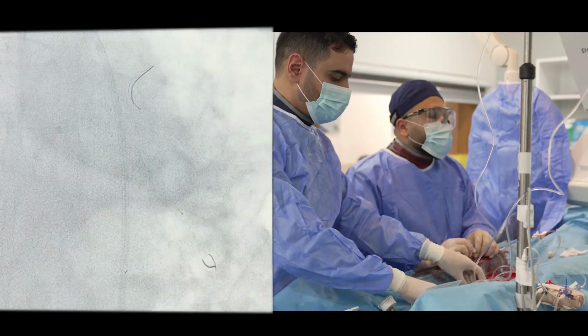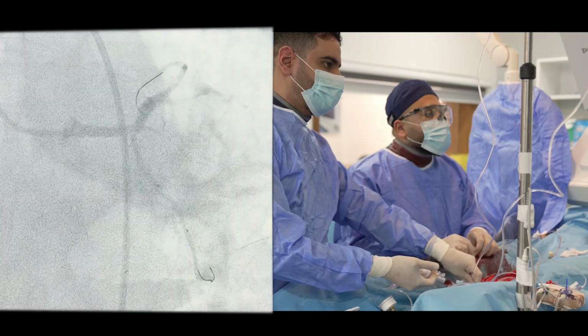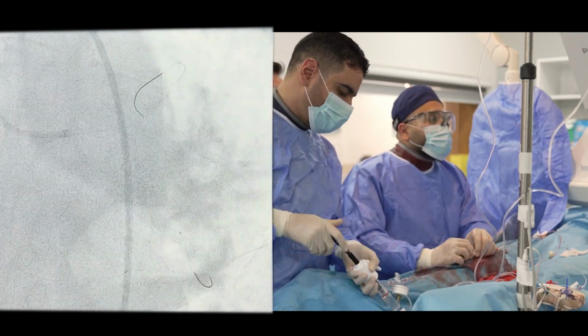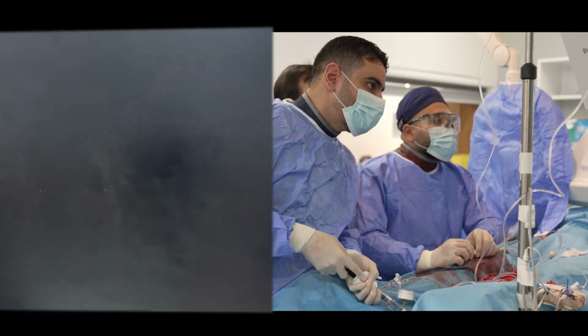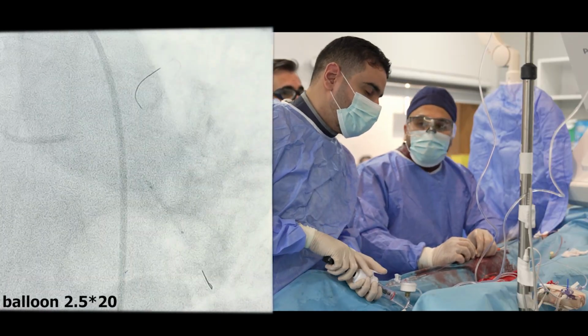Okay, test. Okay, inflate here. Nominal 12. Go 12. 12. Okay, 14, 16. 16.